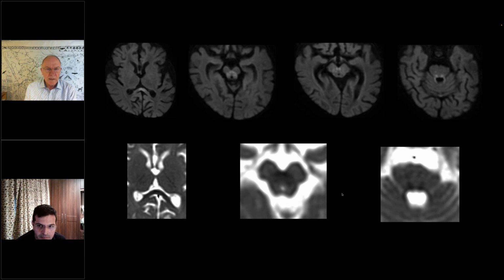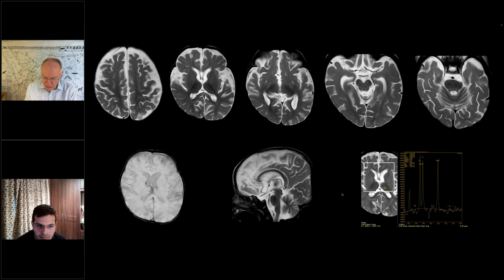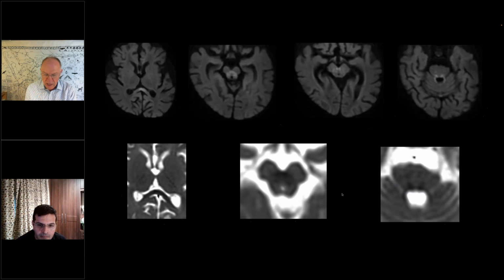This MR reminds me of a case report with GPI anchor disorder with PIGA deficiency. This is a whole group of conditions, about 30 different genes in that pathway, and they can make this kind of picture, but it is not specific.